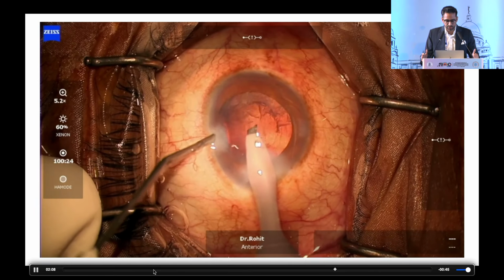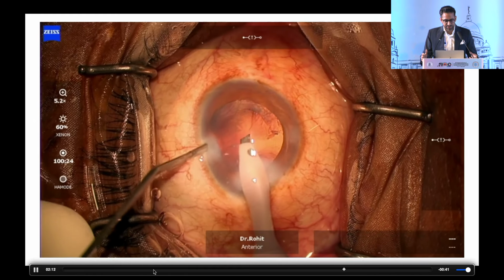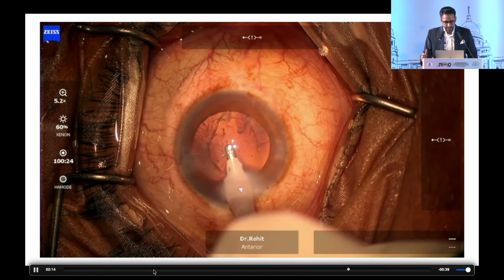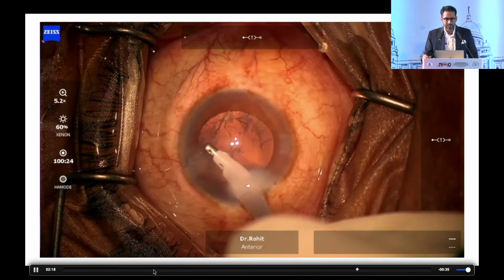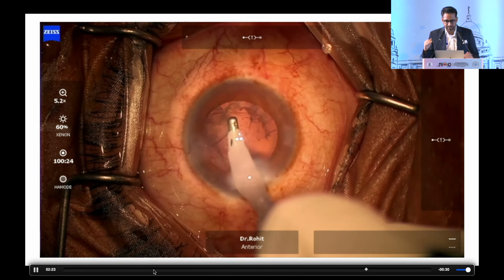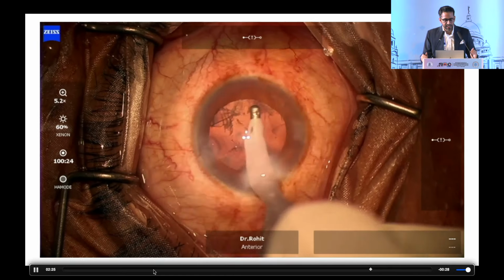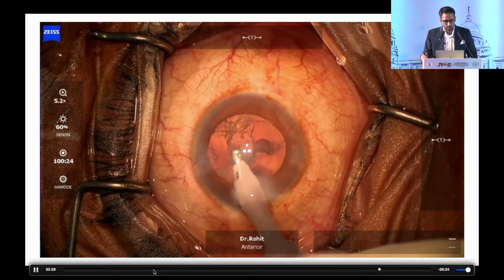Always remember to inject viscoelastic before taking out the probe to maintain chamber settings. Here I use coaxial IA, and I retract the sleeve of the coaxial IA so that I can have a different level of irrigation and aspiration, with low infusion of fluid and low AFR.